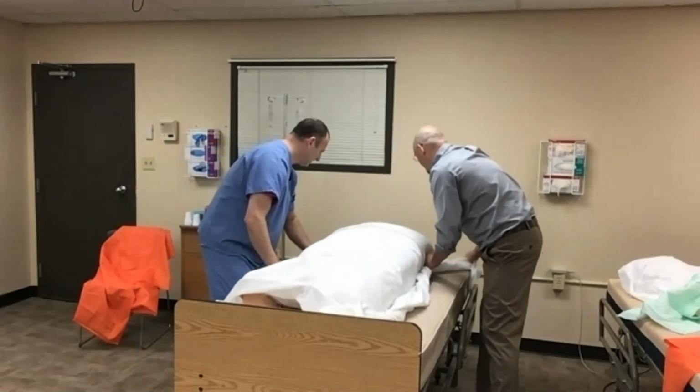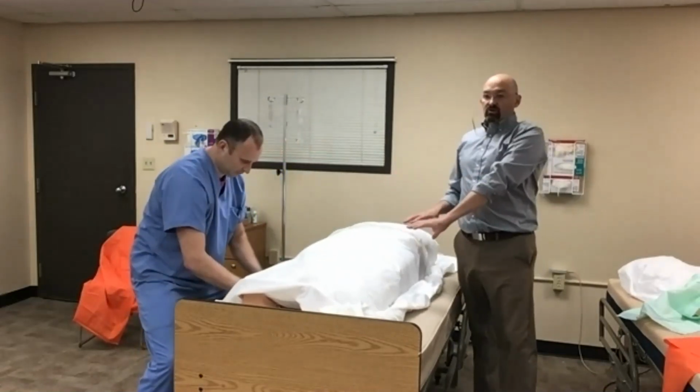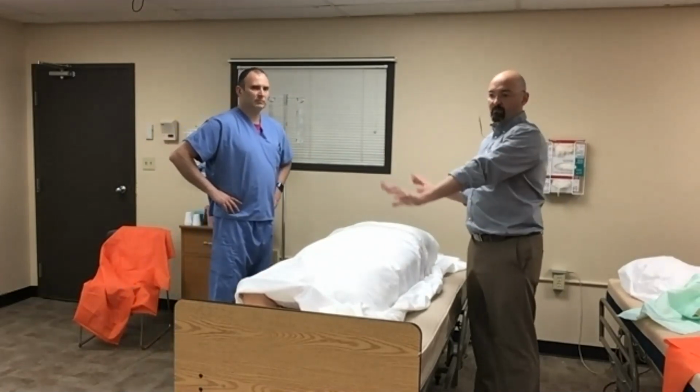So as we're looking at the number of people it takes to do each task, when you're using an air transfer device, the amount of effort is minimal. When we're doing the ceiling lift or floor lift systems, it's a little more effort. There's a lot more going on.